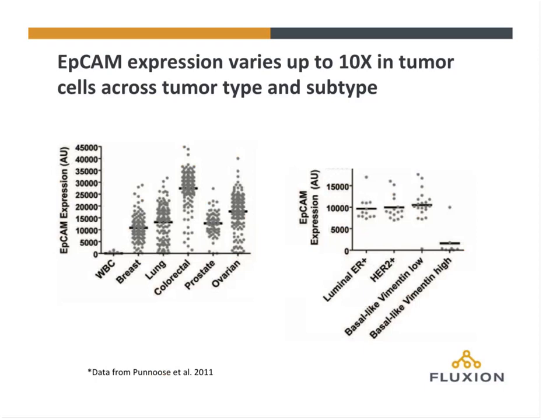I think most people are familiar with the use of EpCAM as an epithelial marker for CTC isolation. EpCAM is a pretty logical choice for many of the common cancer types, but it's come under scrutiny recently for 2 main reasons. One is the limited CTC recovery seen on the CellSearch system, particularly in cancers thought to have lower EpCAM expression, such as lung cancer. The other reason is that research has shown that there can be variable EpCAM expression throughout the tumor, and then this can also diminish over time as the cells enter the circulation.